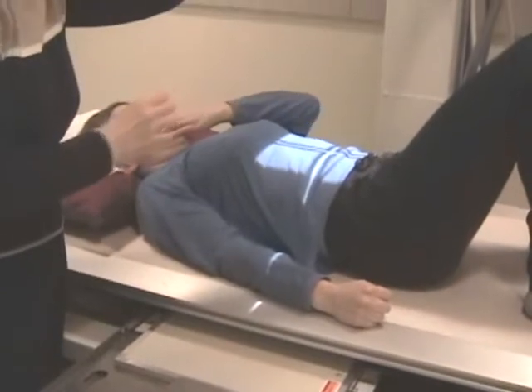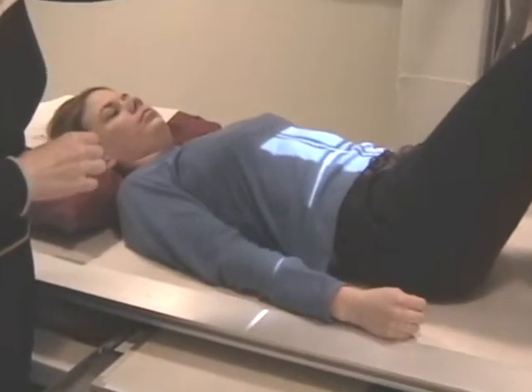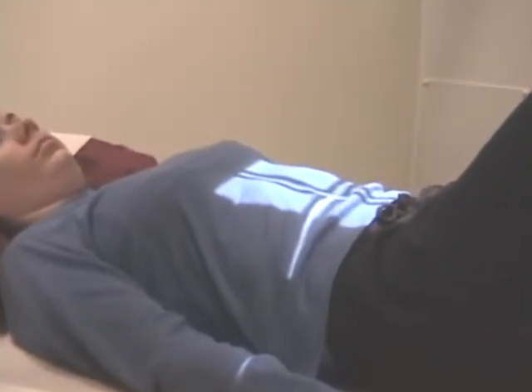I'm going to need to focus on the oblique now. See how I went a little tighter there? I actually have, the gauge says 8 by 14. Leave the length again, but come in side to side.